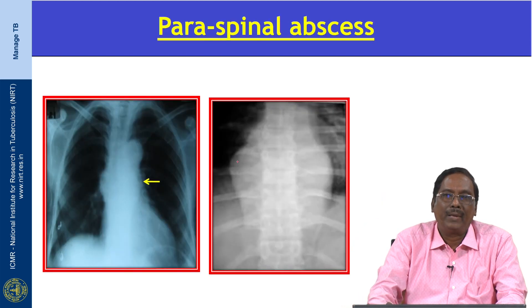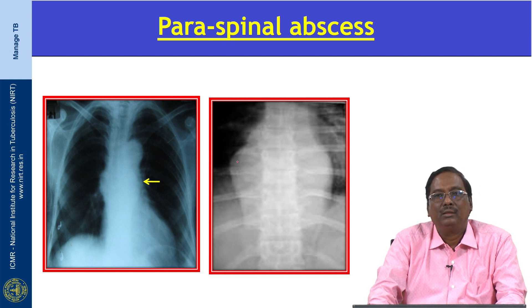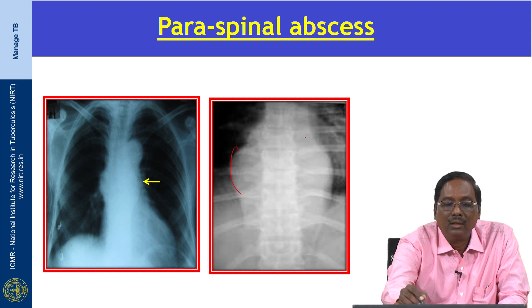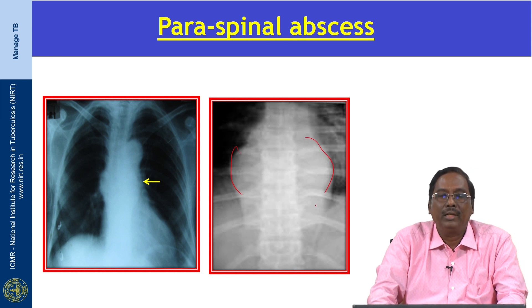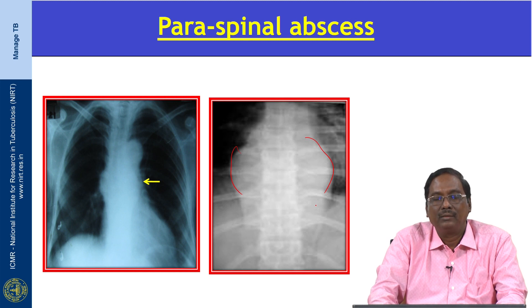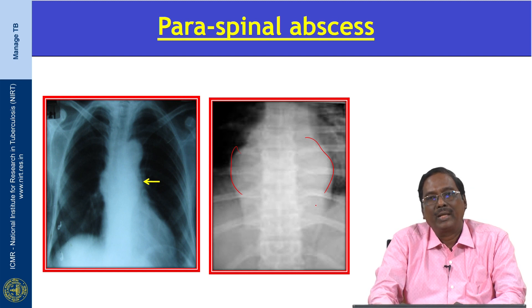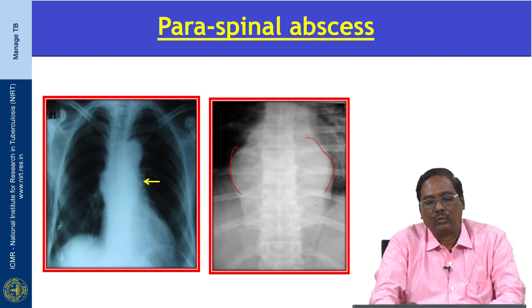This is a paraspinal abscess due to TB spondylitis. It is seen as a fusiform swelling on either side of the spine. The presence of calcification is more in favor of a paraspinal abscess due to tuberculosis.